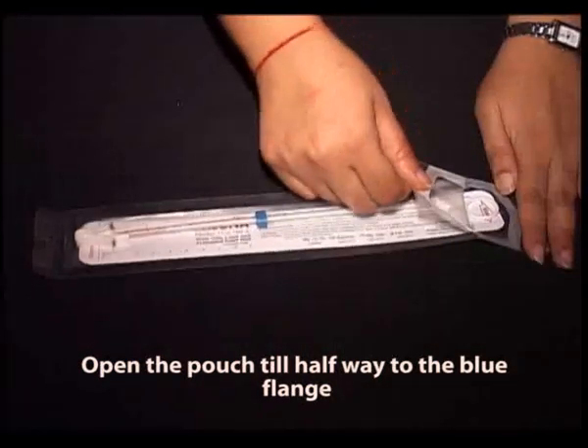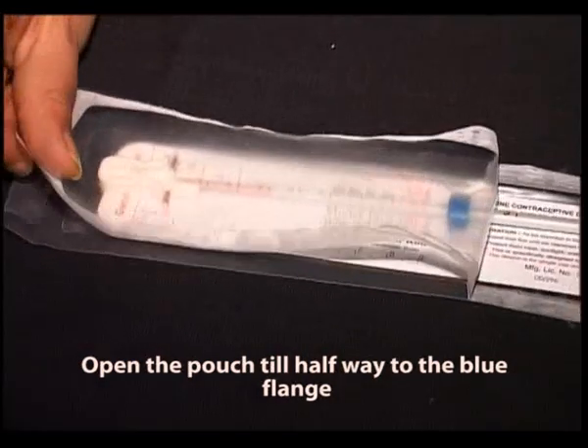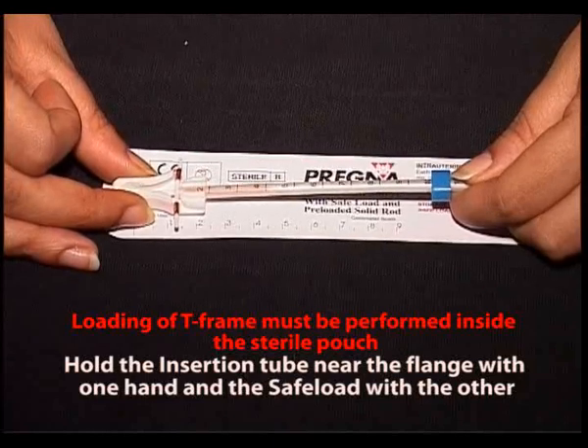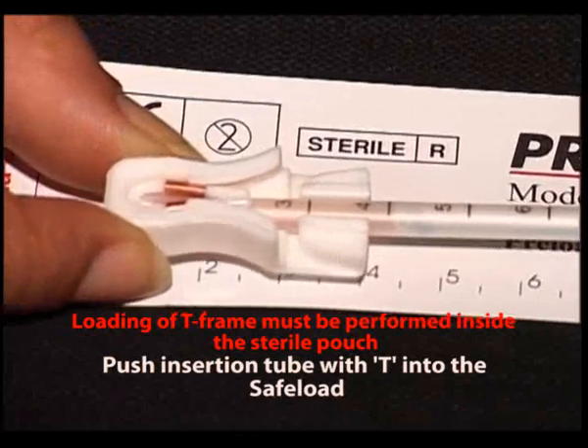Open the pouch till halfway to the blue flange. Hold the insertion tube near the flange with one hand and the safe load with the other. Push the insertion tube with T into the safe load.